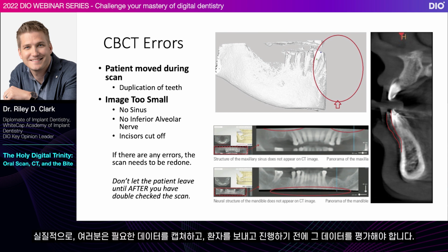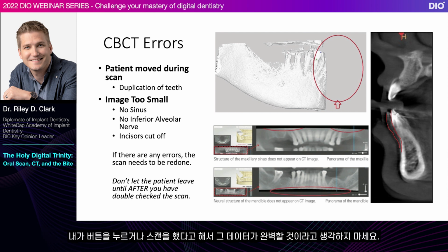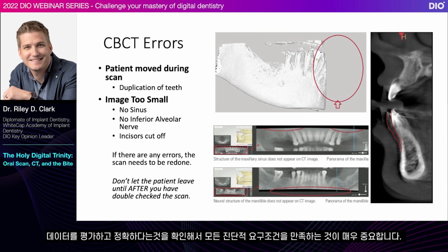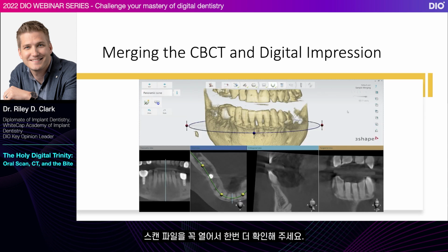Practically speaking, you need to capture the data. You need to then evaluate the data before you go ahead and release the patient. The data needs to be evaluated. Don't just think because I pushed the button or I took the scan that the data is going to be perfect. It's really important that you evaluate the data and make sure it's accurate so it will meet all the diagnostic requirements. So be careful with that. Open the scan, make sure you take a look at it.